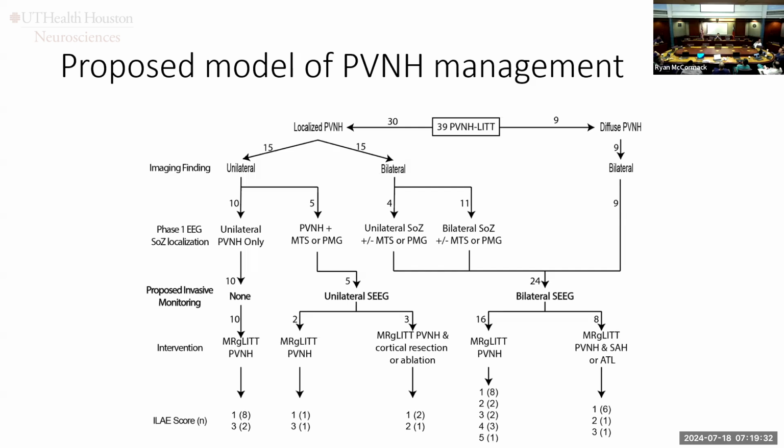So yeah, the major reason for SEEG in these contexts, to take your point of these two patients, is to say: is it MTS or PMG that's actually leading to the epilepsy? You could make the argument and say, well, it's easy, we have a low complication rate, let's just go ahead and do laser ablation from the onset, like you said. Yeah. And if they continue to have seizures, then we carry out an invasive workup at that point.